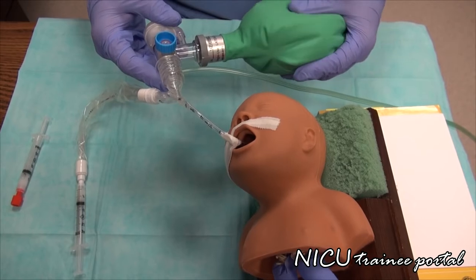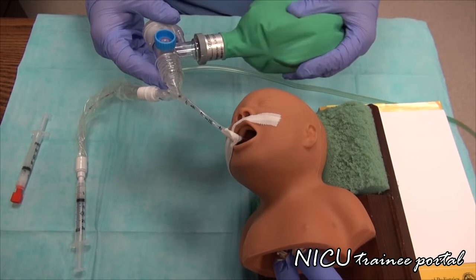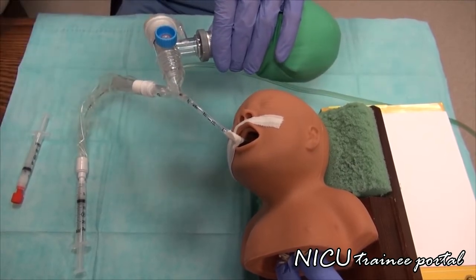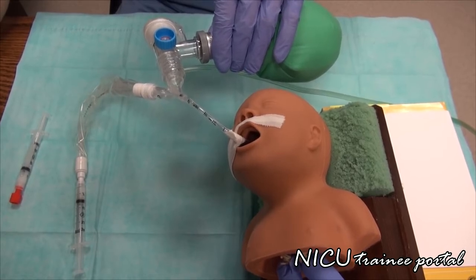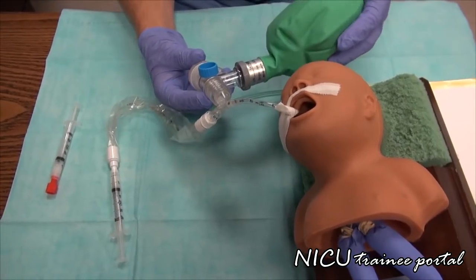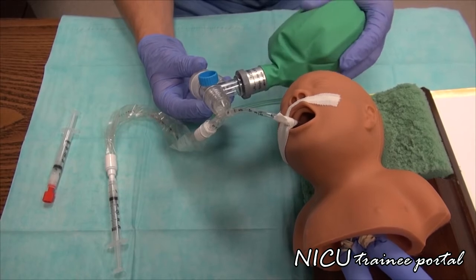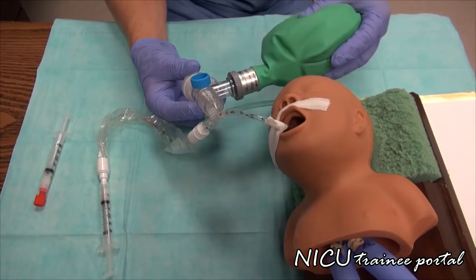Things to consider while surfactant is being administered: like I said, the vital signs, and also after administration, try to wait minimally 1 hour after the administration of the surfactant, 1 hour before you suction the patient. So once we are done administering the first aliquot on the right side and we have returned the baby to the neutral position or on his or her back, repeat the same process on the baby's left side.